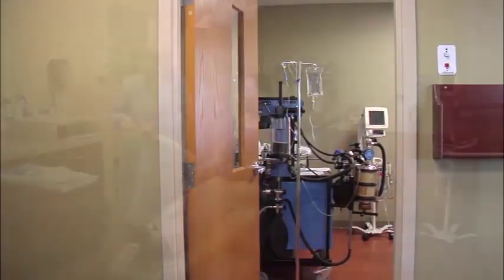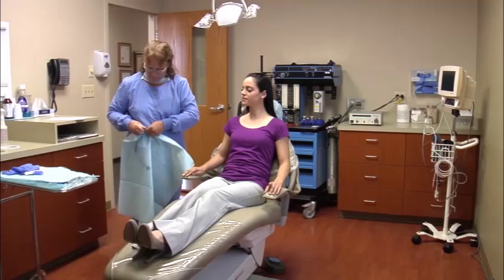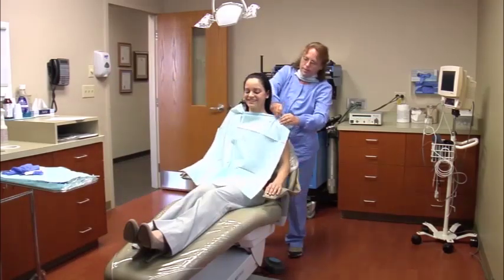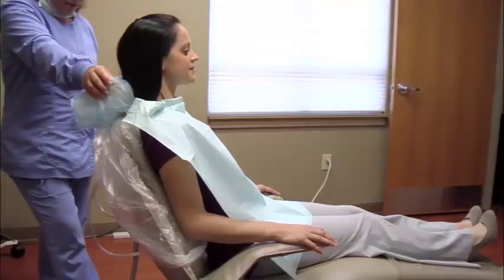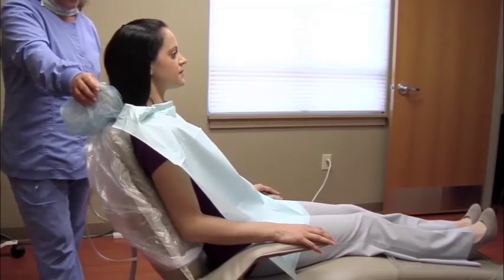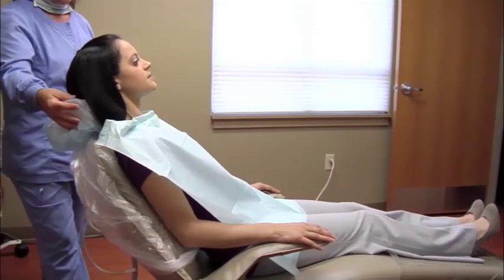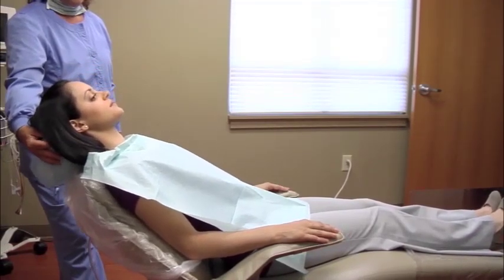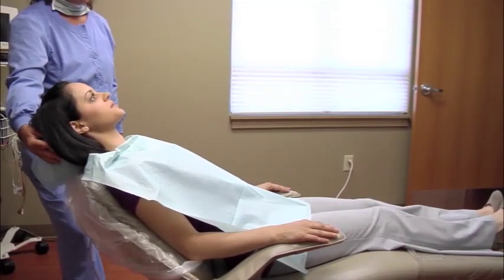a wheelchair or ambulatory. The operating table or chair should feel comfortable to the patient, but more importantly, must permit appropriate positioning of the patient in the case of an emergency. The structure of the chair should be firm enough to permit the delivery of basic life support techniques. If not, a backboard should be immediately available for this use.